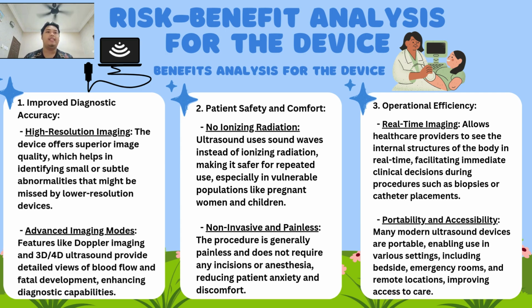non-invasive and painless. The procedure is generally painless and does not require any incision or anesthesia, reducing patient anxiety and discomfort.